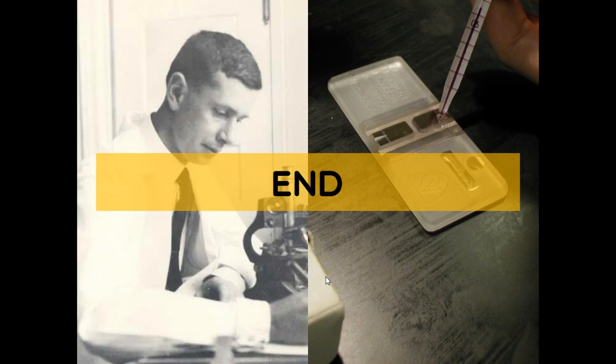Okay, so again, that's all for quantitation of total solids. I hope that's quite clear. Just take note, the main purpose, or the main significance of why we are performing this test, is we just want to monitor the progression of renal disease, not more of diagnosing, because these methods are manual procedures, so there are variations in technique among different medtechs or examiners.